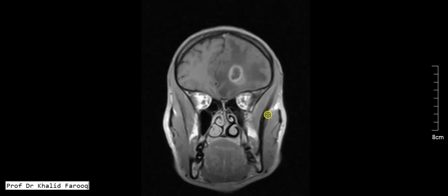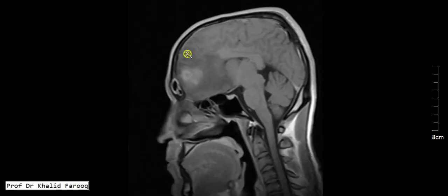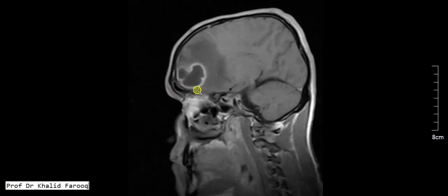On sagittal images, we can see edema and the collection with peripheral post-contrast enhancement. The defect in the posterior bony boundary of the frontal sinus and mild adjacent anterior meningeal enhancement are visible. This is an abscess in the frontal lobe. Thank you very much, assalamu alaikum warahmatullah.